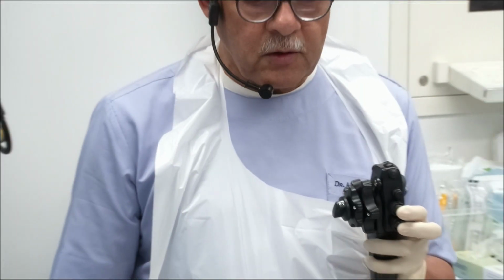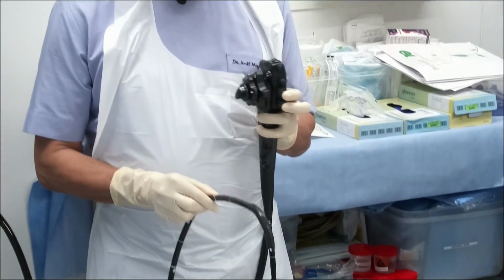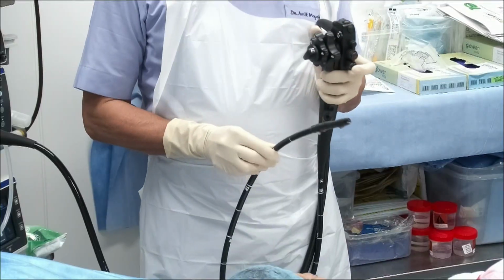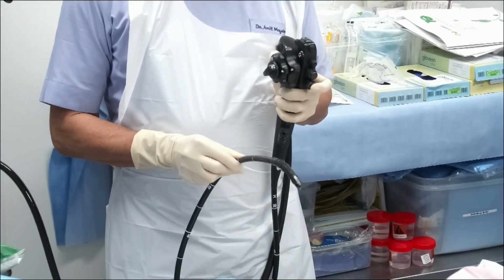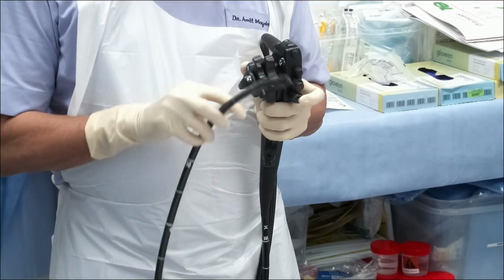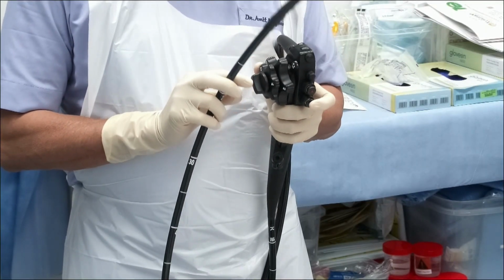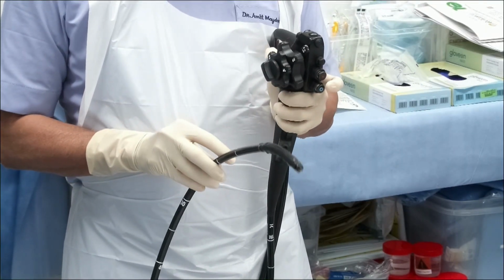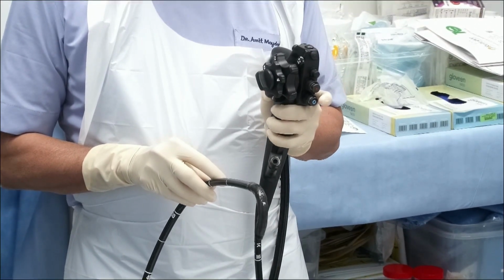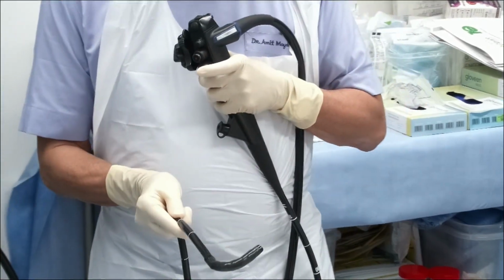Now if we focus on the tip of the endoscope, you see here when I am moving the big wheel, the scope is moving in an up-down fashion. Now to make it move in one single plane, I keep the small wheel in the center and fix it, because this is the knob to fix the small wheel. Now if you see, if I am moving the big wheel up and down, the scope is moving in only one plane. So now I bring the big wheel towards me and I turn the scope in this direction.